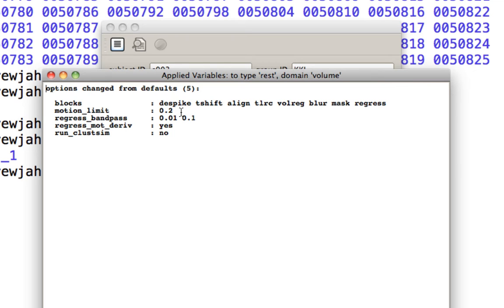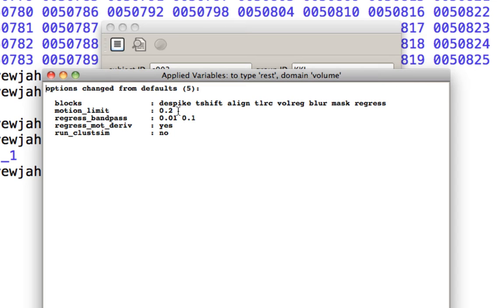Also notice that the motion limit, in other words, the TRs that we're going to censor or remove, we've made that a slightly more conservative or stricter threshold. AFNI defaults to about 0.3 for traditional task-based analyses, but for resting state, since motion is a much more insidious confound, it gets lower to 0.2. So this means that we're going to be probably losing more TRs, but we're also probably going to minimize the confounding effects of head motion.